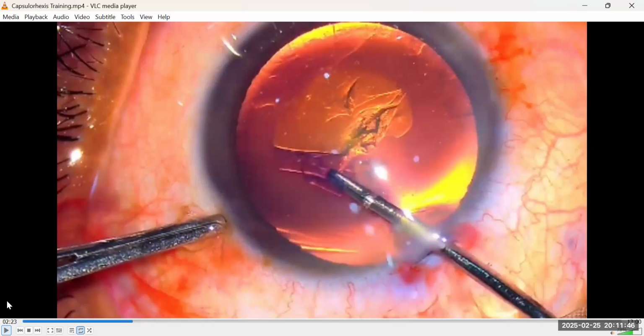Sometimes the sector that you have formed might unfold. If one continues a circumferential tear when this flap is unfolded, there are chances of radialization. At that moment, one is advised to go for a centripetal pull until any envisaged danger is off or over.